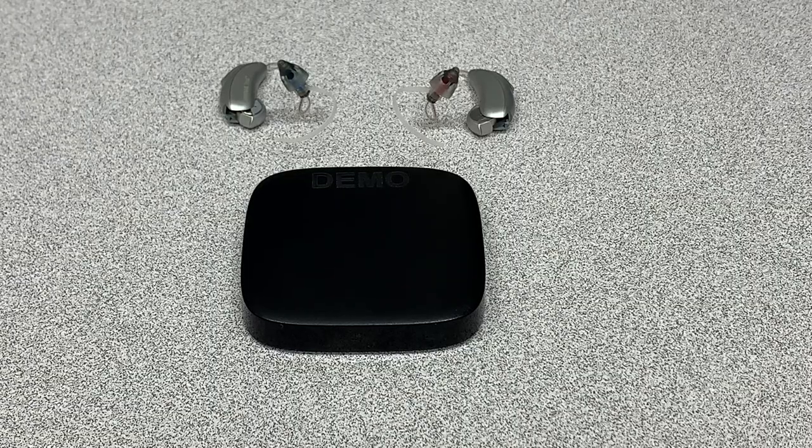This is a video on how to connect a Phonak TV connector both to a media source like a television or compatible monitor, and also to a pair of compatible Marvel hearing aids from Phonak.